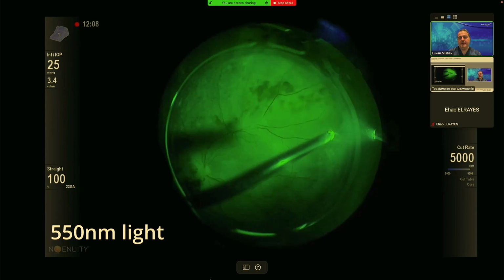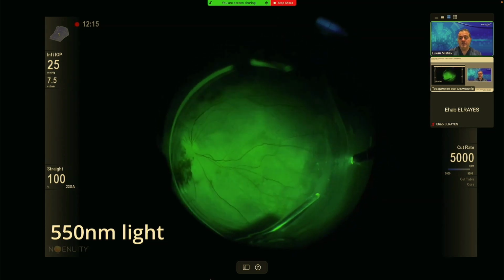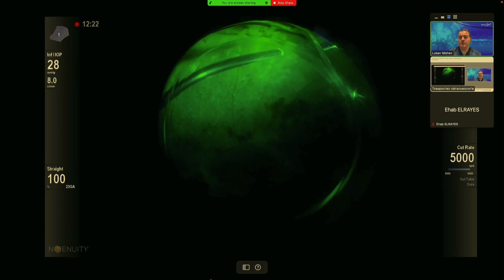and you can see and remove the vitreous more effectively, in my opinion, because in vitreoretinal surgery, if we see, we are allowed to work, and we work better if we see what we are supposed to remove from the eye.